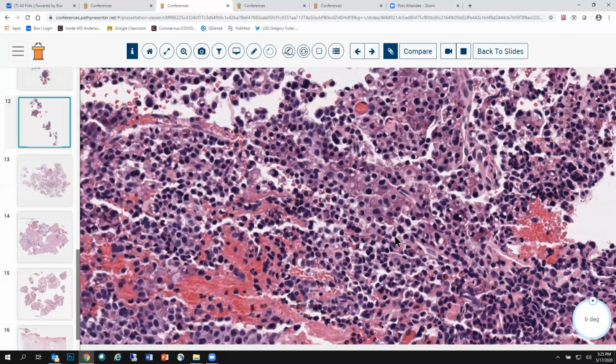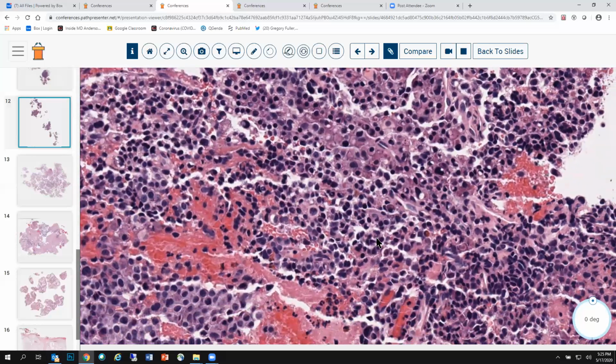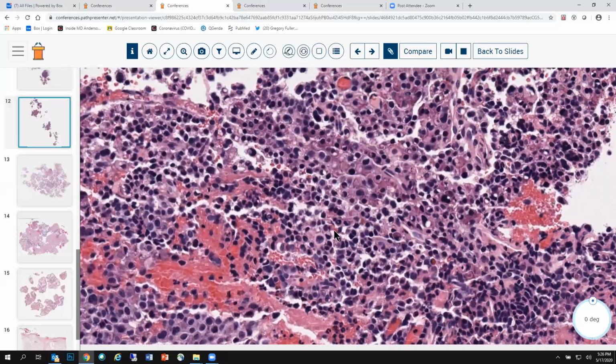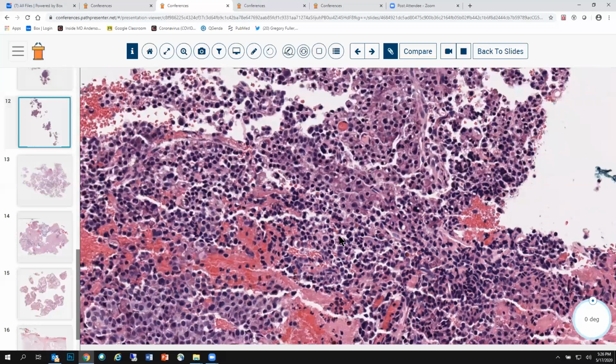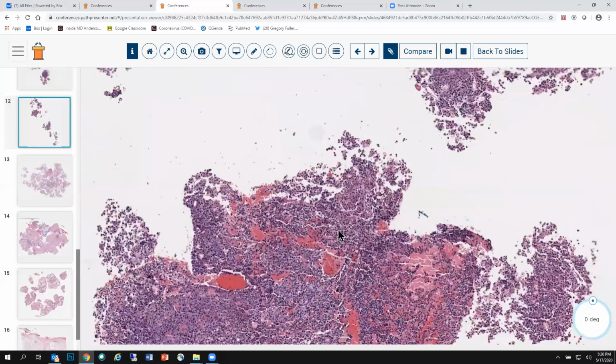Now, one of the things that I hope you're very used to doing, in functional pituitary adenomas, ACTH and growth hormone, is running, in addition to the full panel of the 6 pituitary hormones, CAM 5.2 for keratin. What you're looking for is fibrous bodies. The fibrous bodies usually indicate an aggressive tumor, and the CAM 5.2 will also beautifully stain these Crooke's hyaline rings. You get bonus points if you identified the Crooke's hyaline change in this particular case.